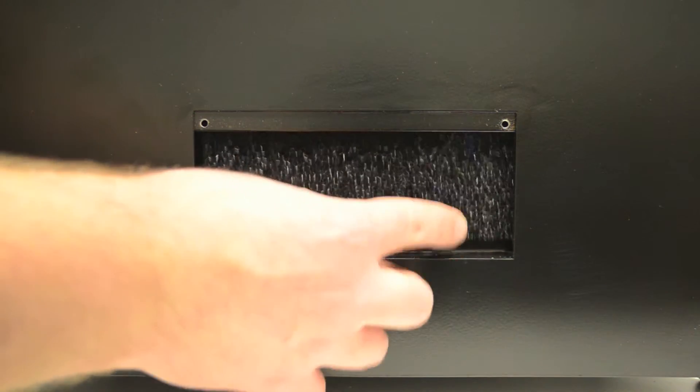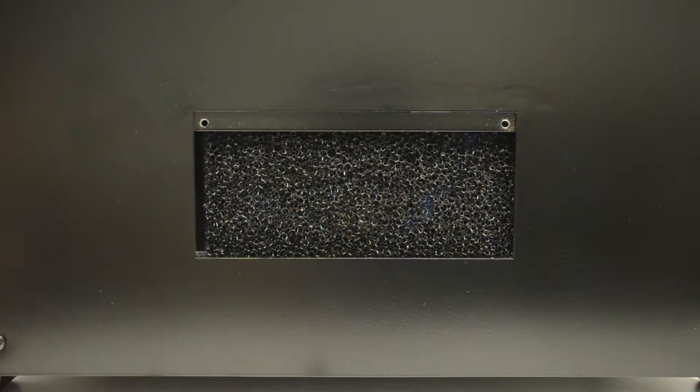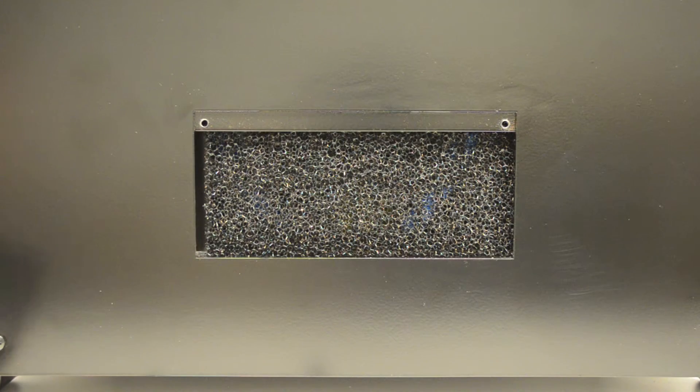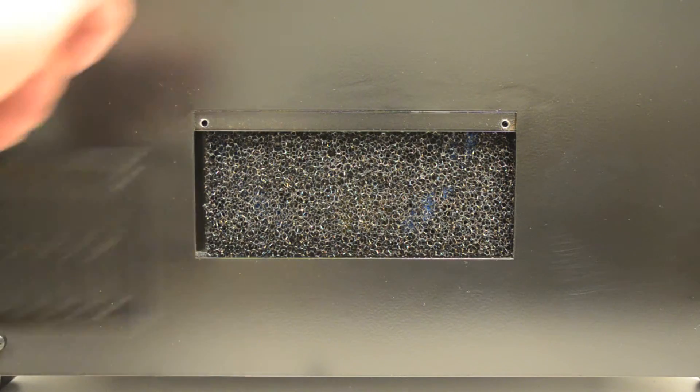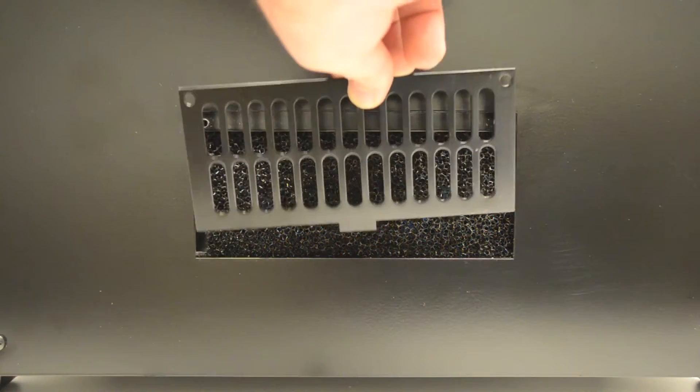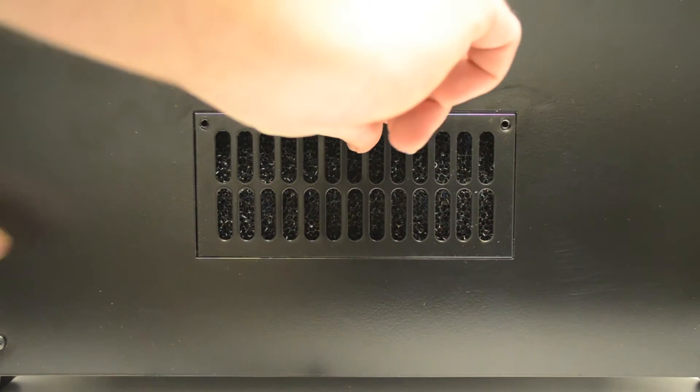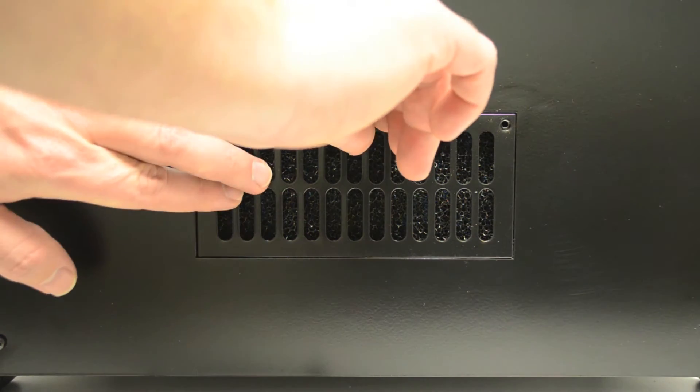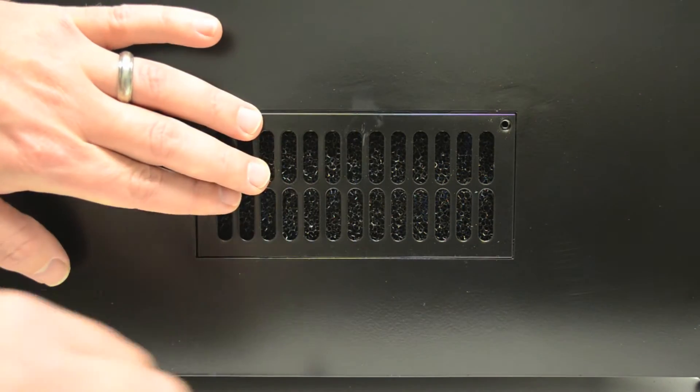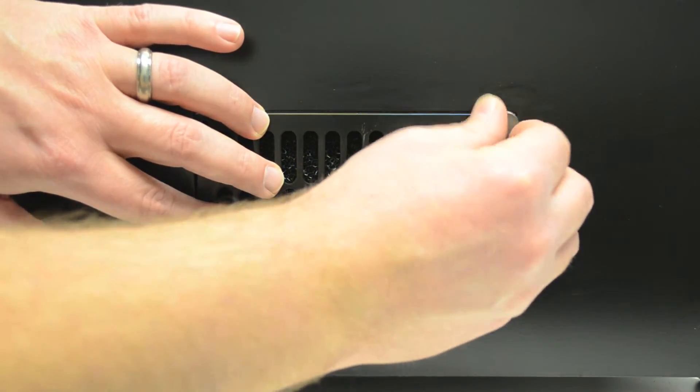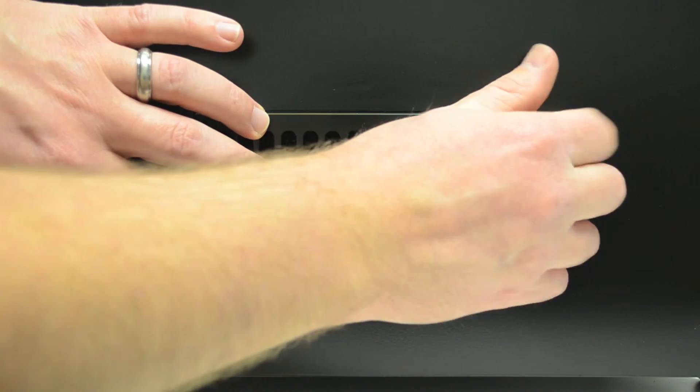Once the new filter is in place, simply put the cover back on and put in the thumb screws.